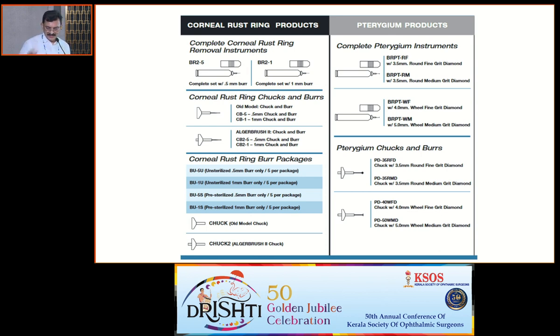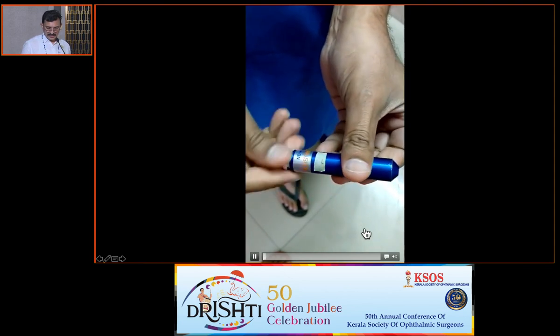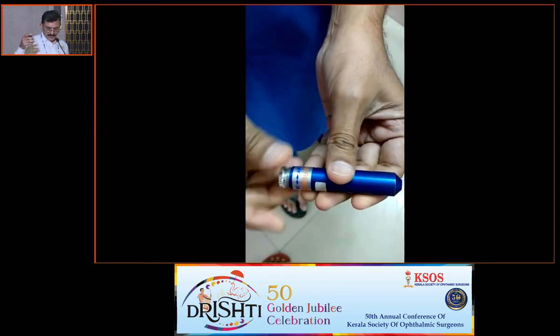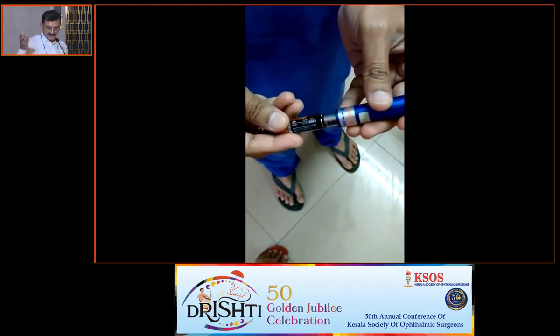When you are buying that, you buy that with the one. You can buy even 2 or 3. Each one they charge around 4,000 rupees. So this is the video showing how you use this one. This is the one, and you unscrew it. You got a battery. You have to know this.